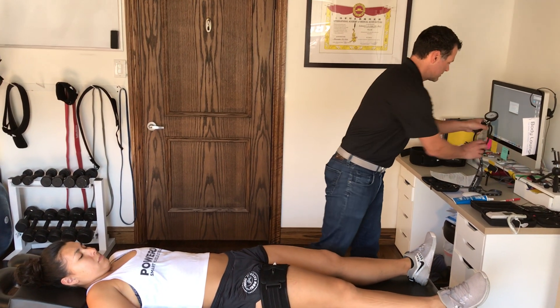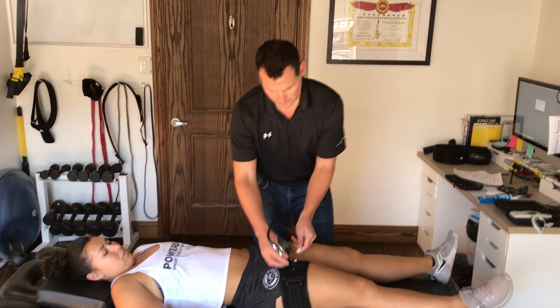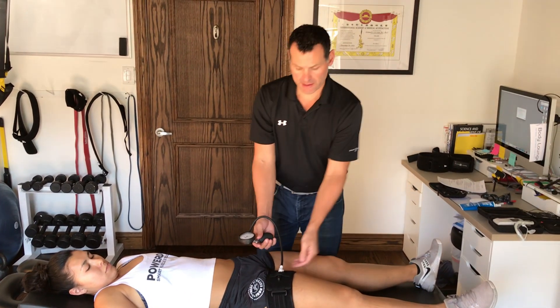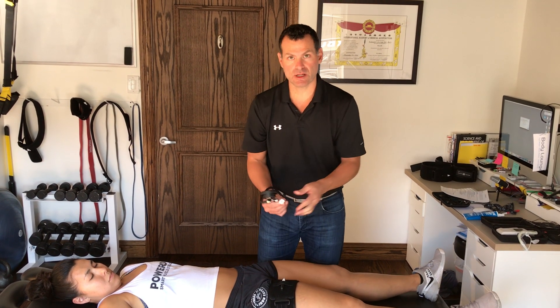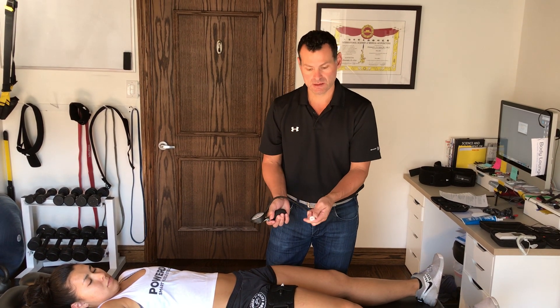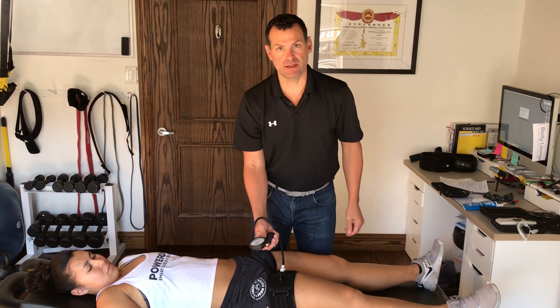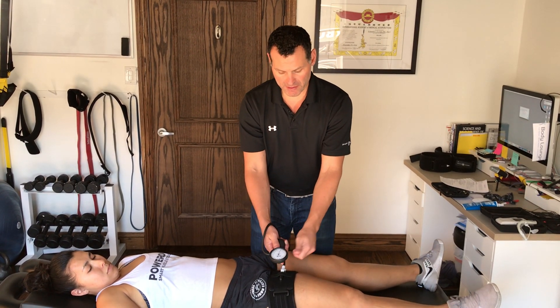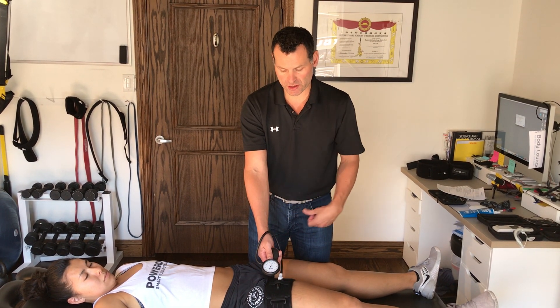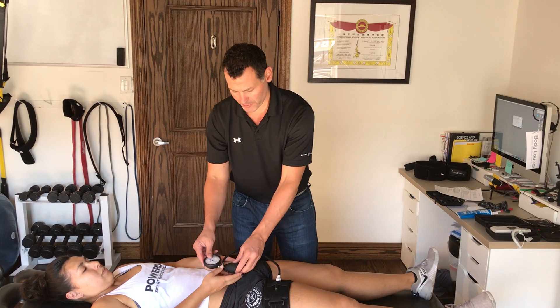I'm then going to apply my clip. If the valve and the stem do not come together, that means you haven't depressed the little metal piece — press it down until you hear the click and it goes in. Now I'm going to open up the valve, turning it counterclockwise until there's zero pressure on the gauge, and then I'll close it back up. I'm going to let her hold on to that for me.